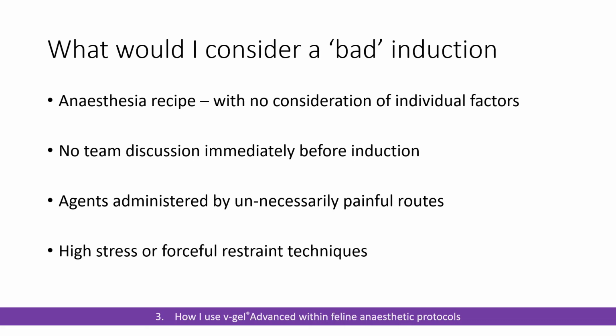In most cases, there are alternatives if we stop and think and just take some time, and particularly if we plan before you start that anaesthesia process in the first place. Most high stress and forceful restraint techniques happen because people didn't think it through properly beforehand.